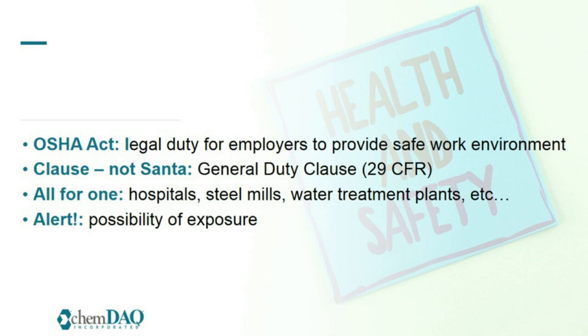Another example is the Ethylene Oxide standard, ETO. It calls for alerting employees where there is a possibility of employee exposure due to ETO in an emergency, and should alert them promptly. Affected employees should be immediately evacuated from the affected area. This is really a big deal.